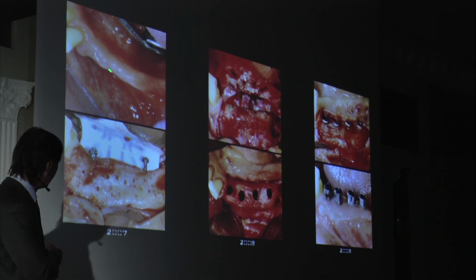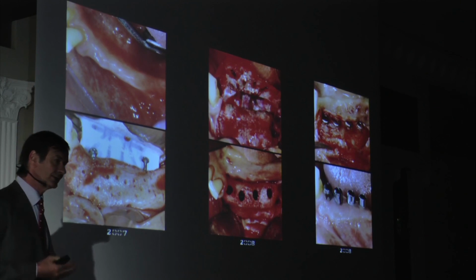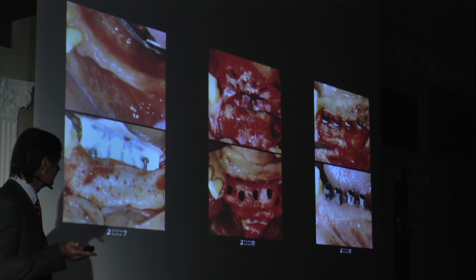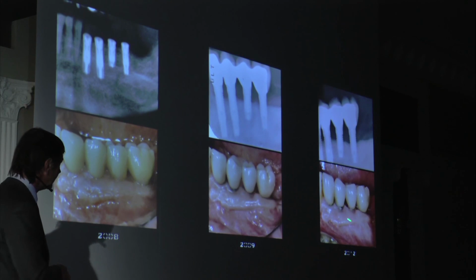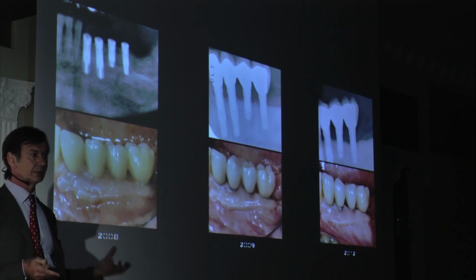And if you look at the results, this is a very nice surgery. Filippo Fontana is one of my best students. Now he's not a student anymore. He is about 40 years old, but he's a very good surgeon. Look at this augmentation. Nice bone, perfect implant position, perfect situation. He did a free gingival graft as well. And the situation in 2008, 2009, 2012, the bone is going, and there is inflammation, exposure outside of the mucosa of the rough surface, which is impossible to keep clean.